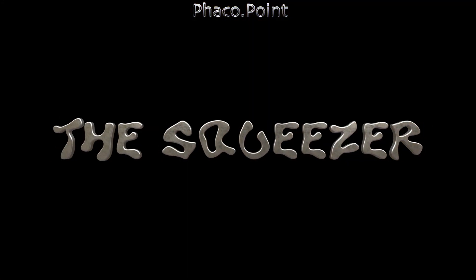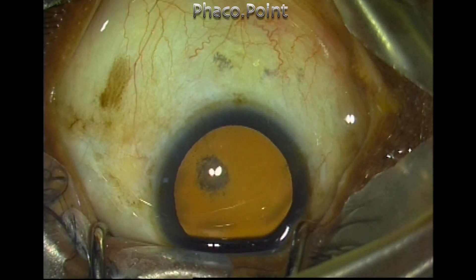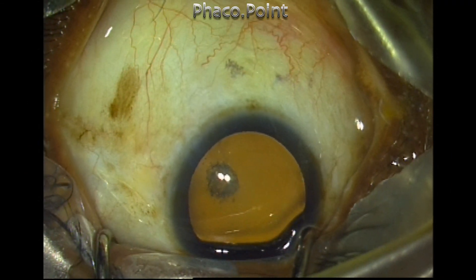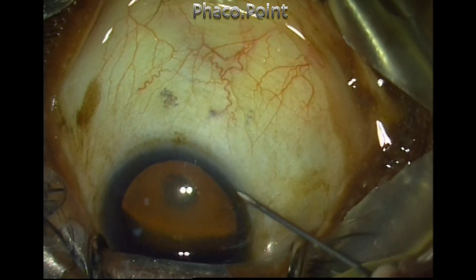The biggest advantage of the corneal pocket is in patients who tend to squeeze. This young lady with a posterior subcapsular cataract was being operated under topical anesthesia and was tending to squeeze her eye. You can see there is a prominent Bell's phenomenon.